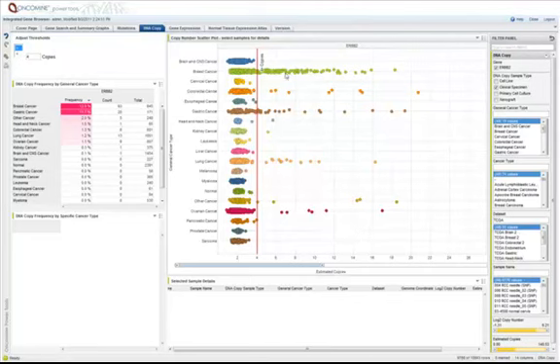We're organized by cancer type, and we have estimated copy number on the x-axis with our 4 copies threshold highlighted here. And what you can see is exactly what the frequency data told us. Frequent amplifications in breast cancer, frequent amplifications in gastric cancer, but rare amplifications in other cancers as well. So we see here in lung cancer, 1.2% with 13 out of 1,000 cases.